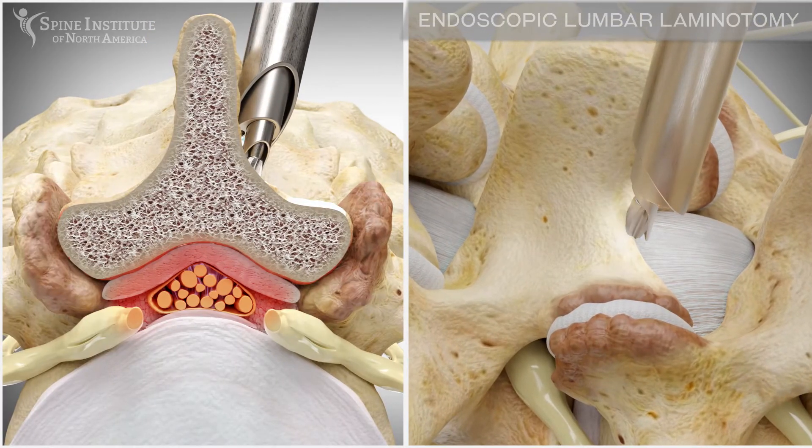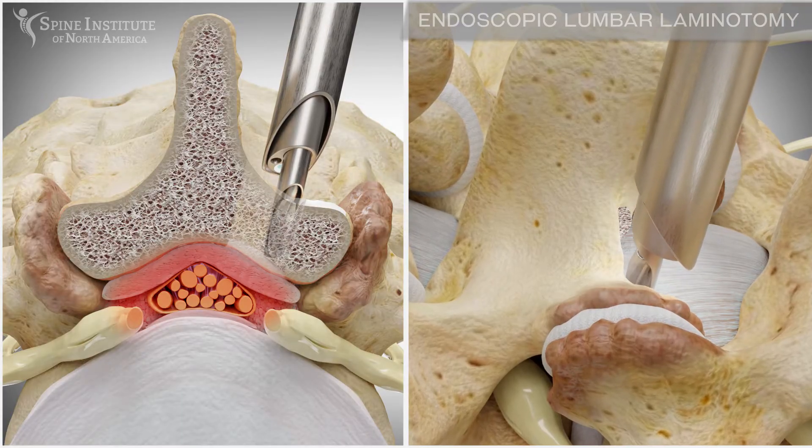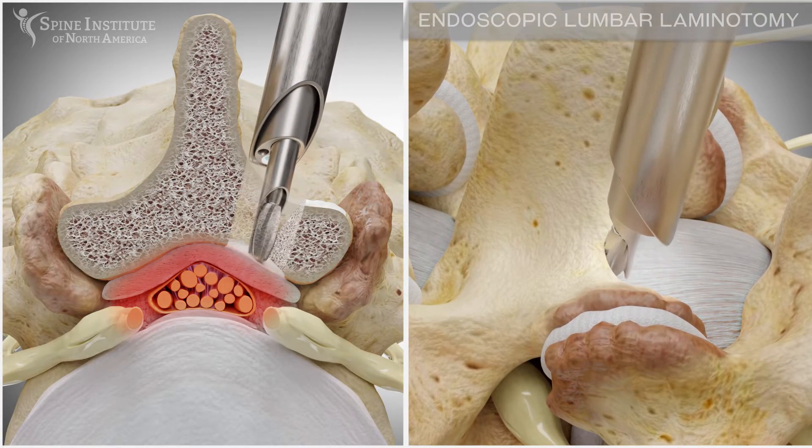A spinal endoscope and specially designed surgical instrumentation are used to remove the bone overgrowth, thereby relieving the pressure on the spinal cord and nerves.